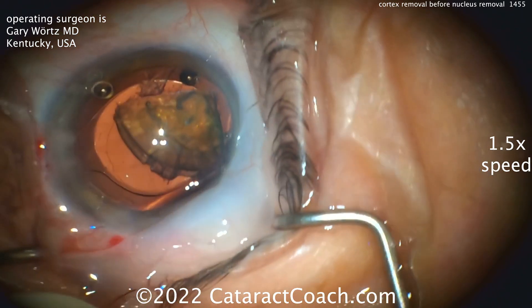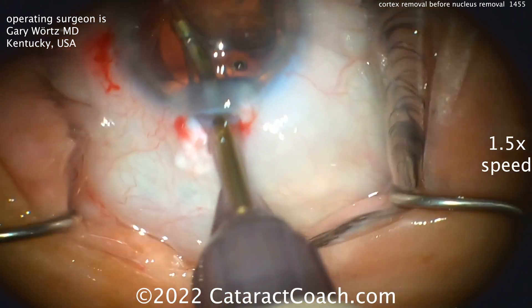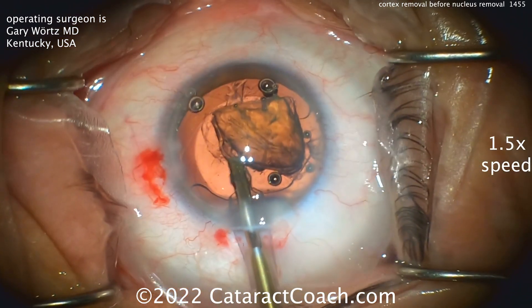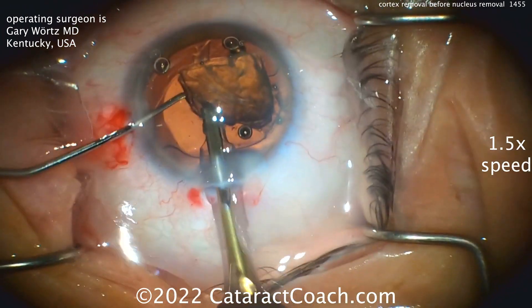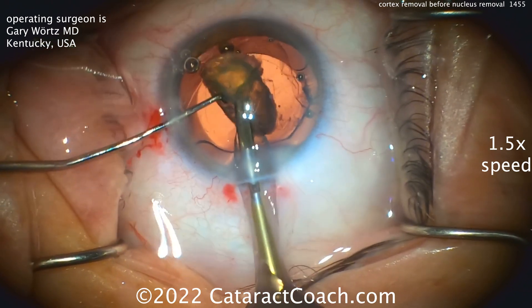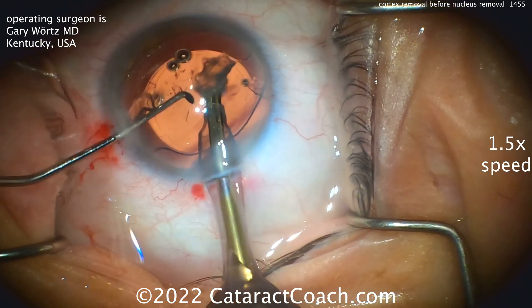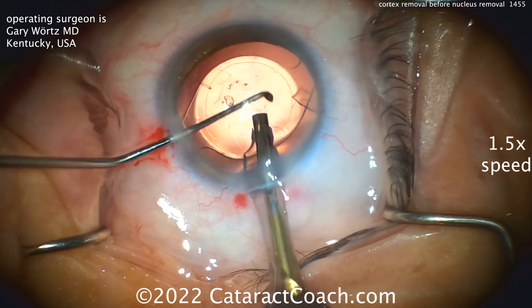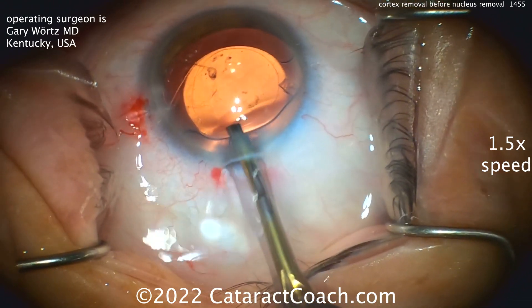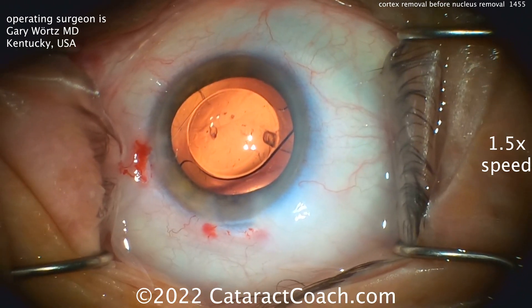The speculum has to go back into position — this patient's squeezing so much, they're bending the metal speculum. And then now that last piece can come out. You can do it with almost impunity because no matter what happens, you're not going to hit the capsular bag — your capsule is safe because it's protected by that optic. There's the last piece of lens material, and all the viscoelastic is coming out of the eye quite nicely. If you want, you can switch over to the IA probe for those last little fragments — maybe you can get behind the IOL that way.